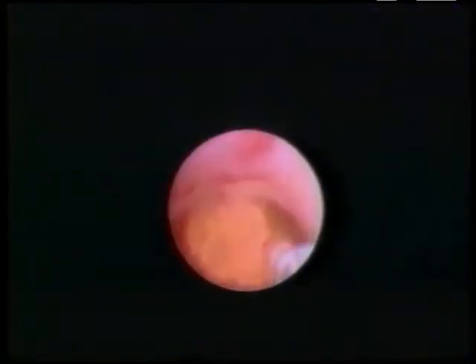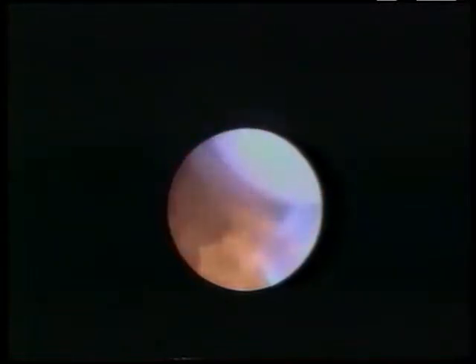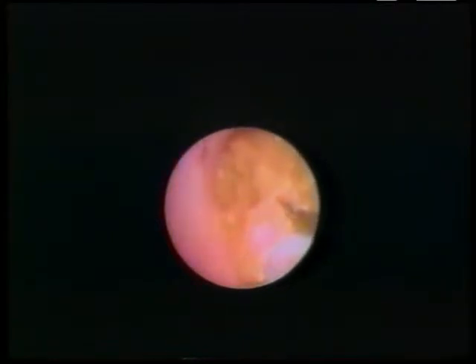The mid-ureteral calculus was approached with a small diameter rigid ureteroscope. It was clearly too large to retrieve, and the 365 micron laser fiber was passed into approximation to the calculus. Fragmentation was begun with the laser set at 0.6 joules with a frequency of 6 hertz. This was increased to 8 to 10 hertz with 0.8 or 1 joule during treatment to increase the rate of fragmentation. Irrigation was maintained through the instrument with saline.